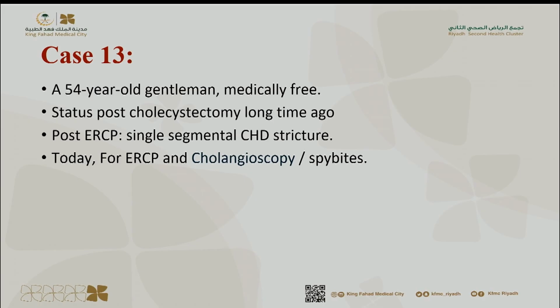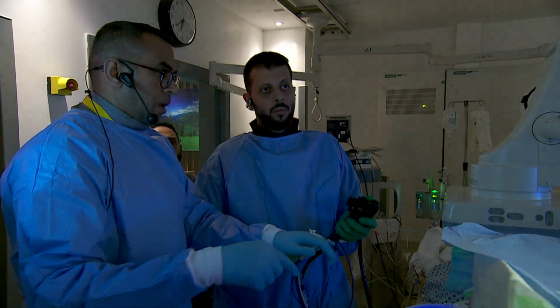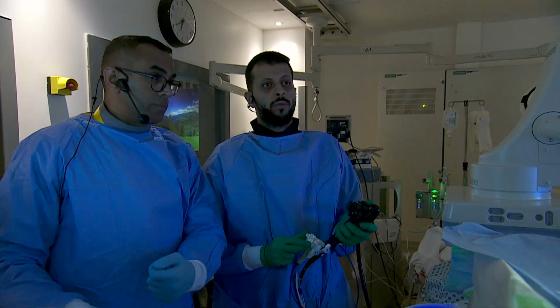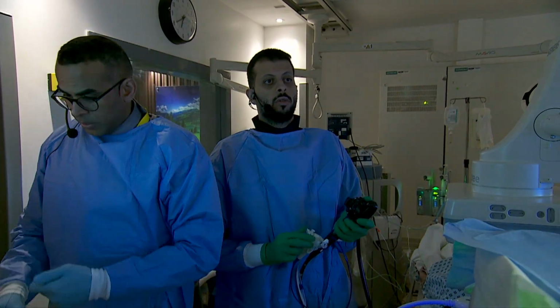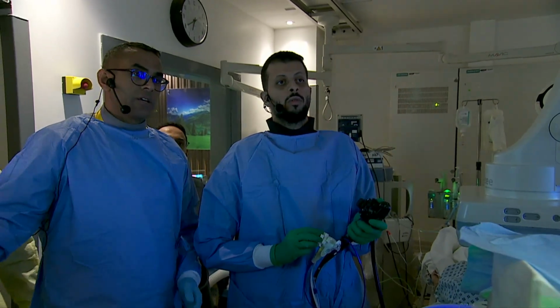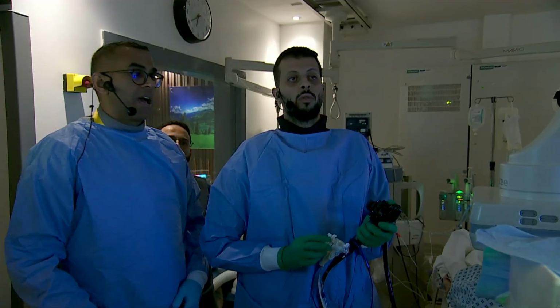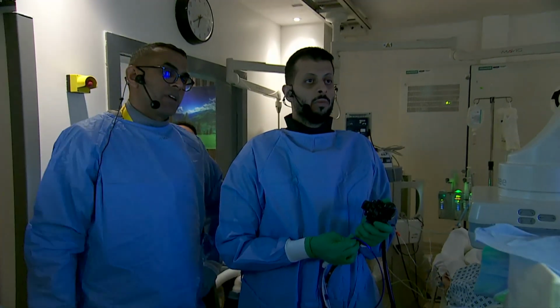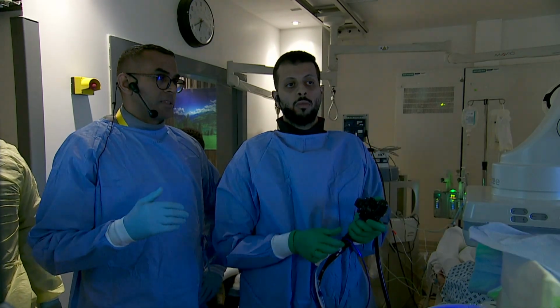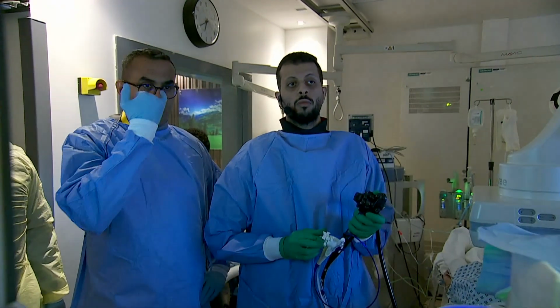Okay, thank you, Abrar. So if we can switch back to the room, please. Yes, Dr. Imad, hello, Dr. Saad, everyone. How are you? Thank you so much for streaming into our room. As explained in the presentation, this patient has a biliary stricture located at the junction between the common bile duct and the common hepatic duct.